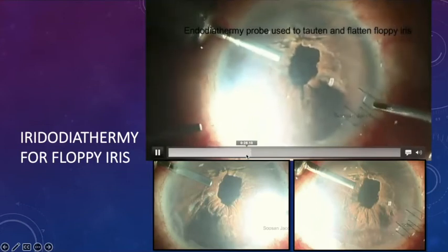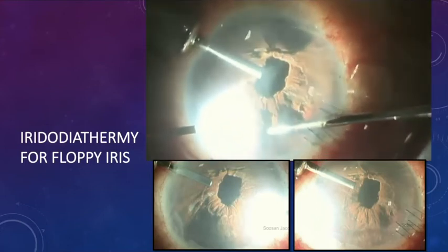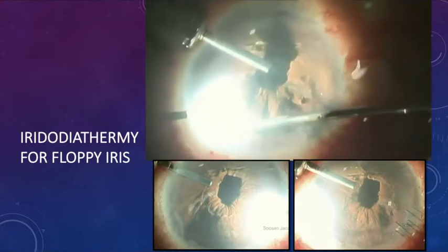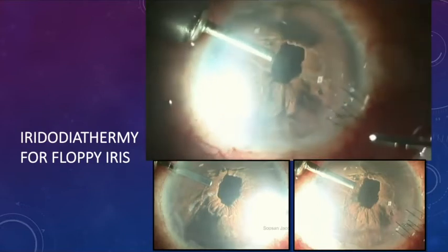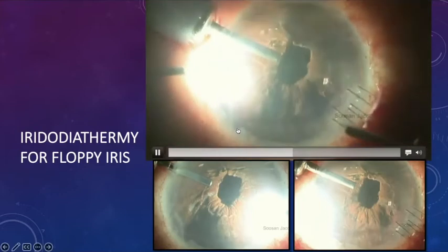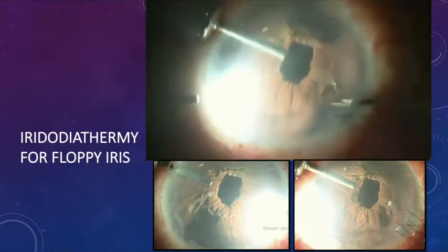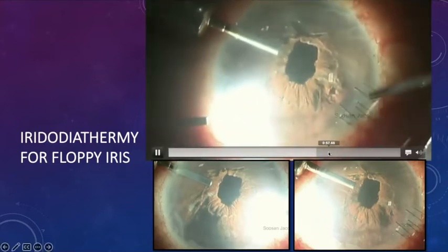So what I do in this case is use the endodiathermy to flatten the iris. So watch carefully, that floppy iris immediately becomes flat. So you can actually see it flattening out, and all the floppiness is gone because the iridodiathermy actually shrinks the iris a little bit in that area and removes the floppiness. And now you get a nice stable iris IOL diaphragm, which is going to give you much better support for the corneal graft than what you had previously.